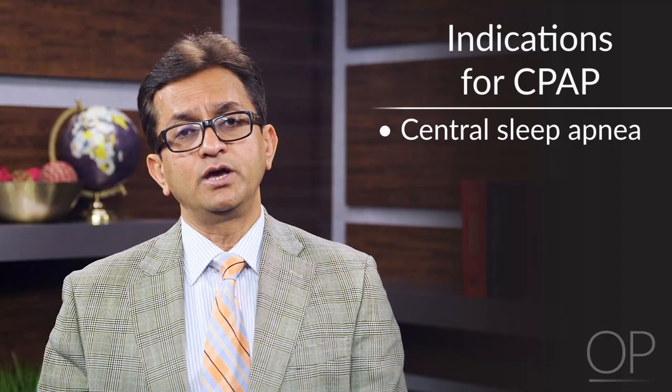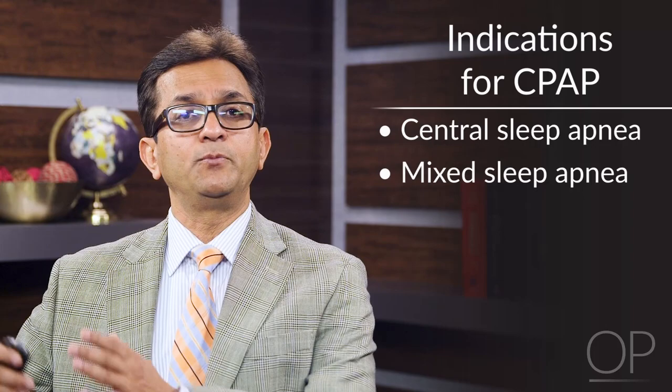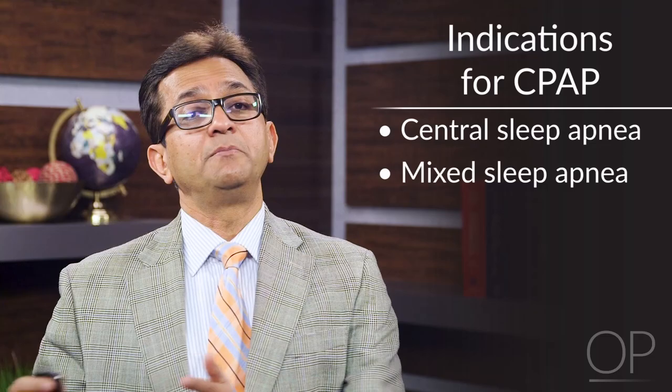Mixed sleep apnea. So these patients are predominantly obstructive in nature. Because of the recurrent obstructive cycling, they can get post-arousal centrals. So by treating obstruction by CPAP, you can treat the centrals because you stabilize the sleep.